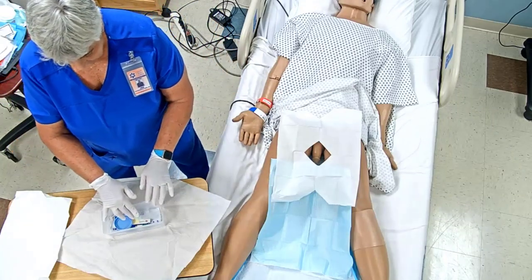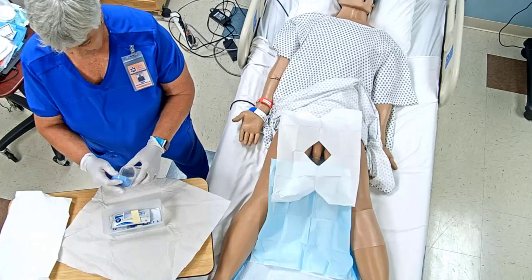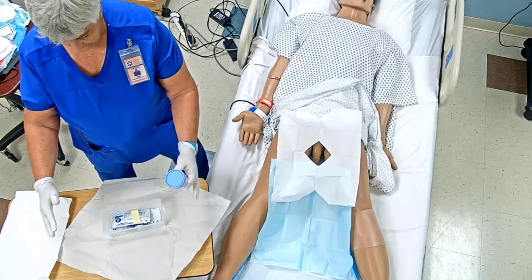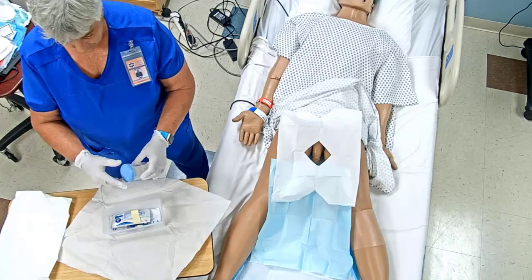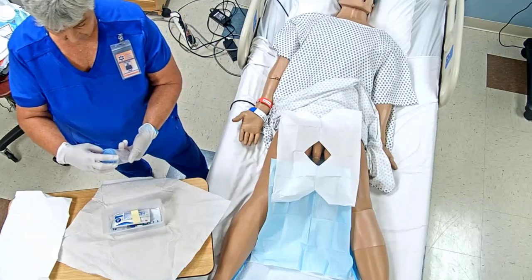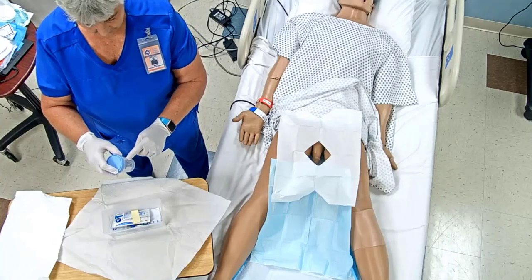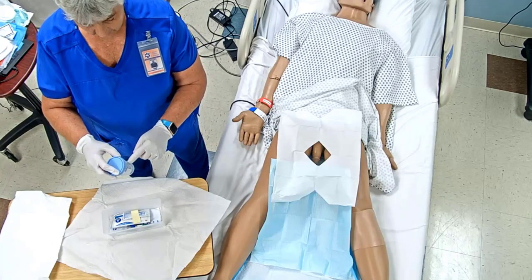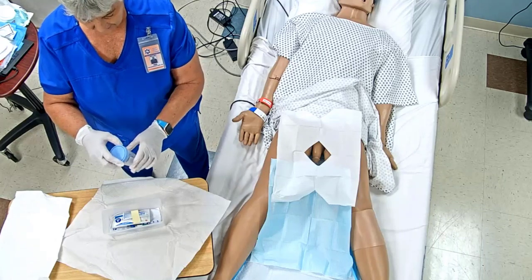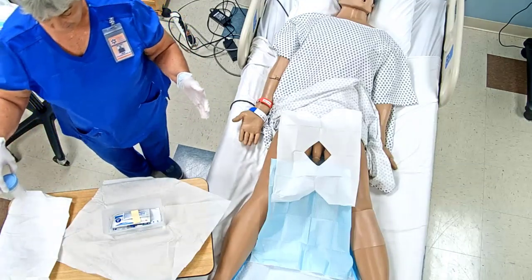Okay, so we are going to be getting a specimen. Now, I'm known to be the T-Rex, so that means my elbows are at my waist, because if you start reaching over, then you're probably going to be reaching over your field. So I'm going to go ahead and just take the lid and the cup. We need a specimen, so we need to make sure we have a sterile cup. So what needs to be sterile is the inside, okay? So the inside of my cup has to stay sterile. So I'm just going to go ahead and put this over here on my glove package.